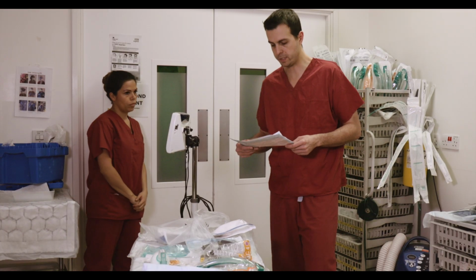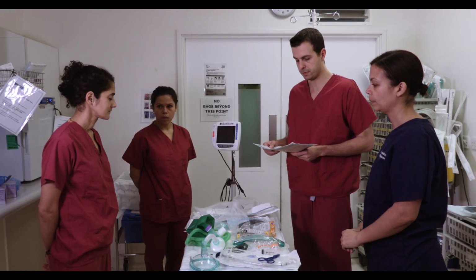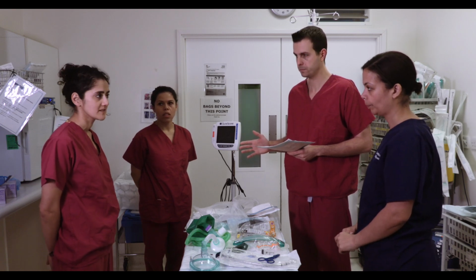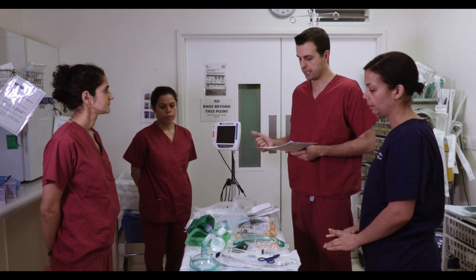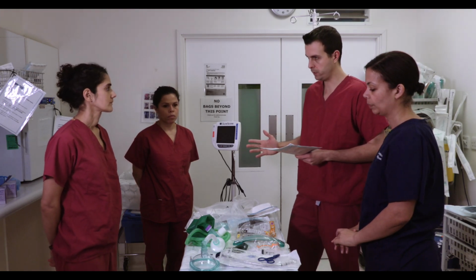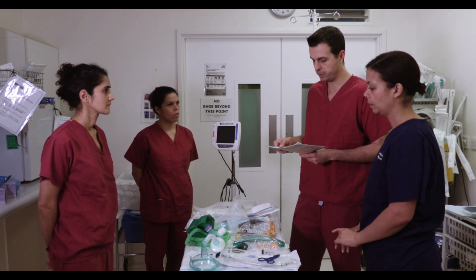So now we're going to stage 3, discuss airway plan. 3. Team brief airway plan. We're going to pre-oxygenate for 3 minutes. Would you like us to do cricoid? Yes, we'll have some cricoid to start off with, but if there's any difficulty, I'll ask you to take that off. Okay. Quickly. So plan A will be our best attempt, video laryngoscopy with stylet. We're going to do 3 attempts for intubator number 1, and I'll do 1 attempt as intubator number 2.